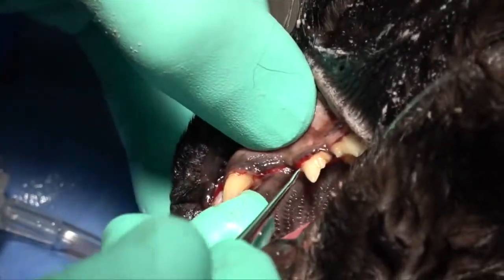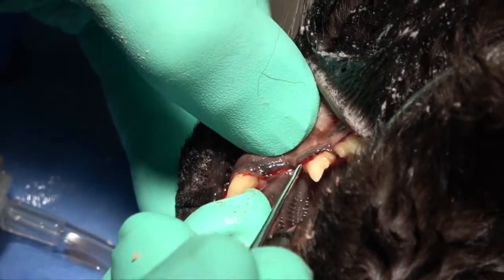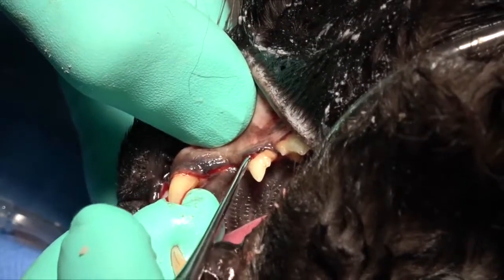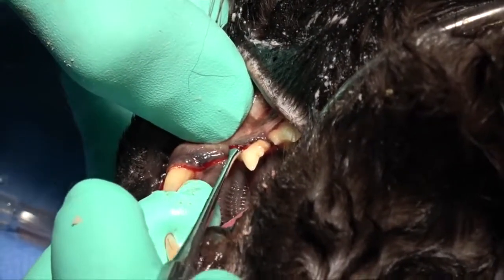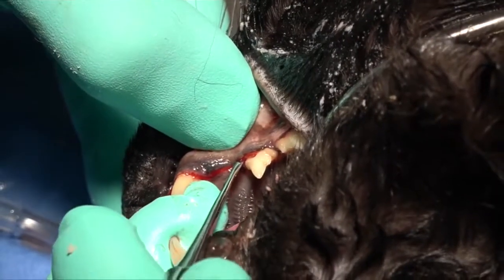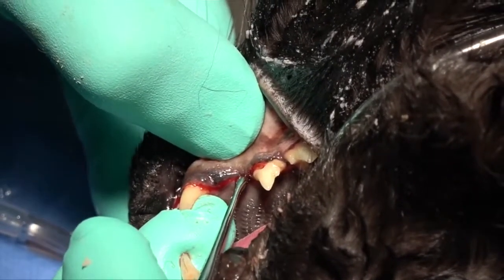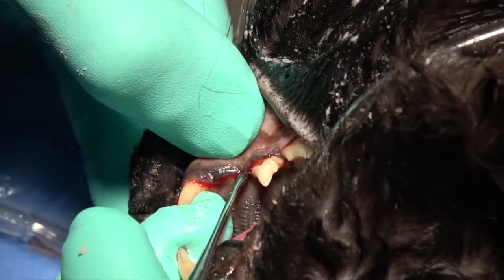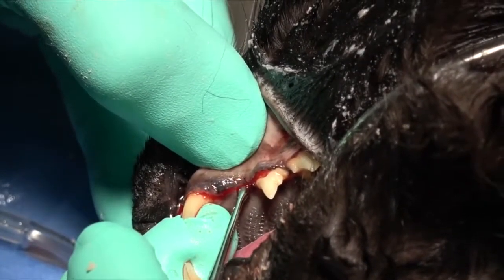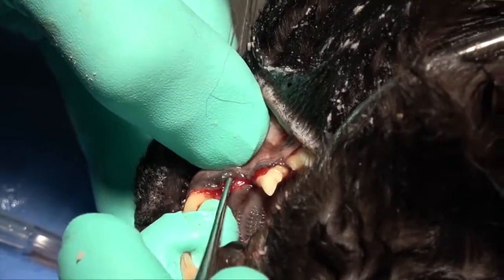Any attachment caudal to that canine and around that third premolar can be very difficult to get up, and you also have the bone expansion that can cause some difficulty in getting that attached gingiva off of that bone as well.